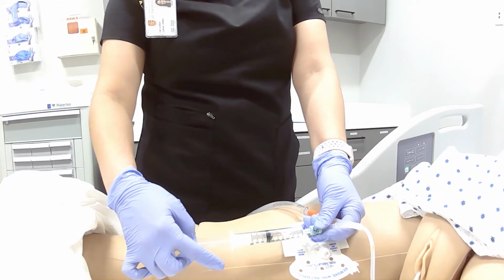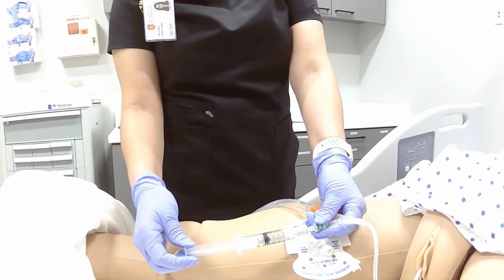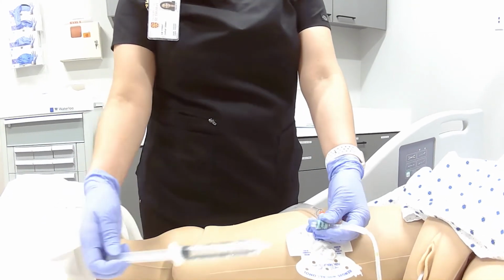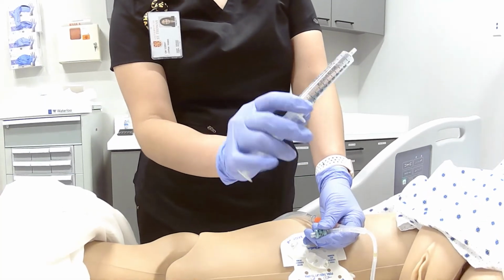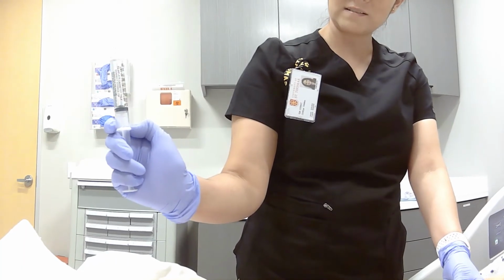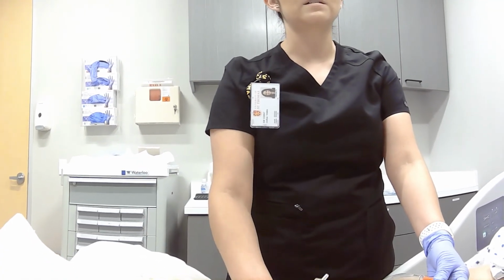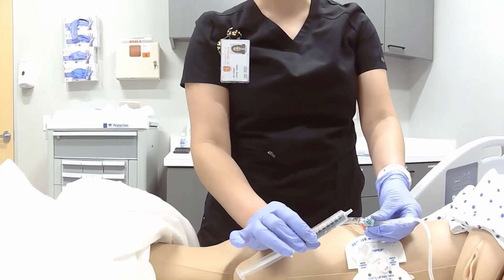Pull on it gently, because if you pull on it too hard, it's going to wrinkle the balloon catheter tip, and then it's going to hurt the patient as it's coming out. Okay. Oops, I pulled on that too hard. So you'll never really get the exact 10 cc's back, depending on how long that catheter's been in. You'll get about 9.5, which is what I got back. That just happens from the water getting reabsorbed into the system.